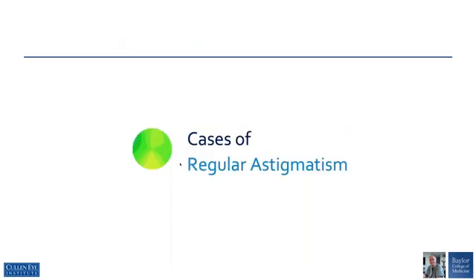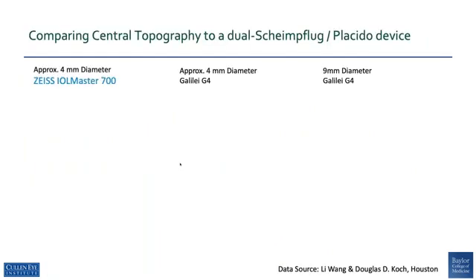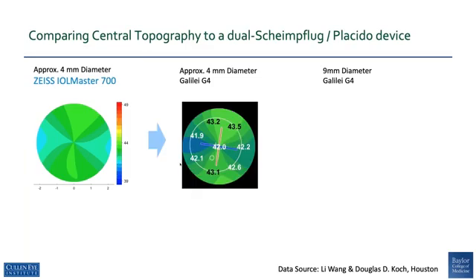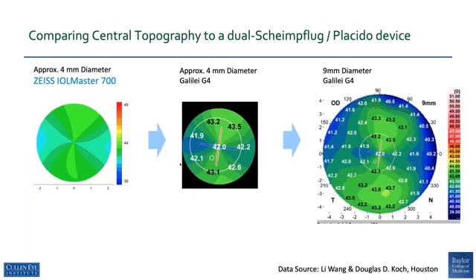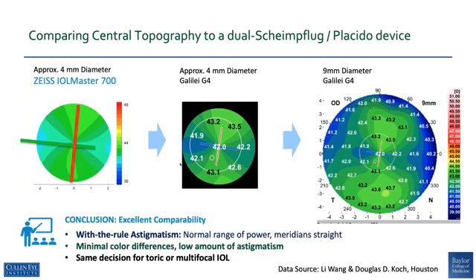Let's look at some cases of regular astigmatism, comparing central topography to a dual Scheimpflug Placido device. The IOMaster 700 is on the left showing the four-millimeter zone; this is the Galilei G4 showing the nine-millimeter zone. You can see the axes are similar, there's a normal range of power, the meridians are straight, there are minimal color differences, and a low amount of astigmatism. The clinician would make the same decision regarding a toric or multifocal IOL for that patient.